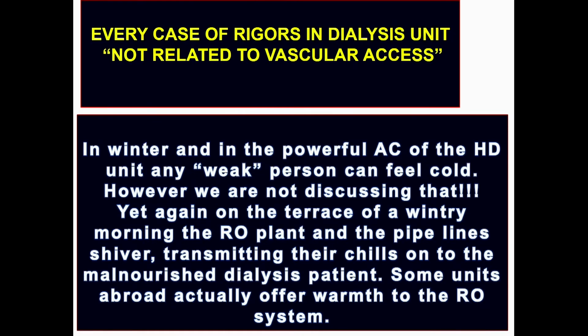Simple things first. In winter and in the powerful AC of the HD unit, especially if you have a weak dialysis patient, he can feel cold. But that's cold, not really rigors. So one needs to differentiate between the two. Yet again, on the terrace of a wintry morning, and we are in Maharashtra, so it's not that bad, but in northern India, the RO plant and the pipe also shiver, transmitting the chills onto the malnourished dialysis patients. So they are just simple things I thought before we go on to the scientific major issues.